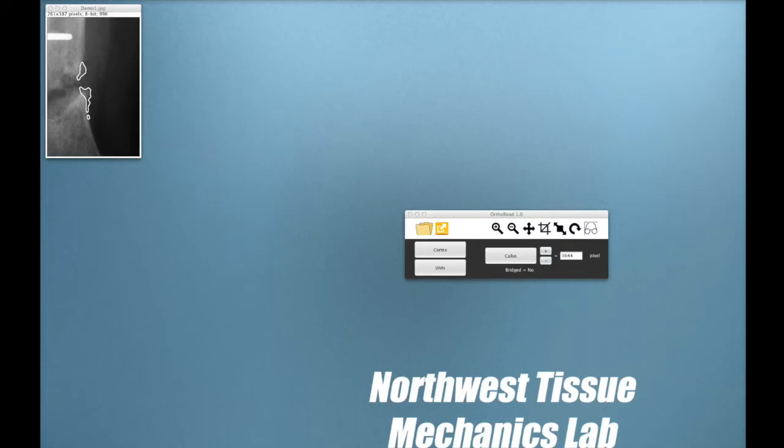If you have not yet watched our basic tutorial, it is recommended that you do so to gain an understanding of the basic features of OrthoRead and how to segment fracture callus. In this video, I will be covering some of the more advanced features of OrthoRead, which include converting results to millimeters squared, operating multiple images, and an overview of some of the tools OrthoRead is equipped with.